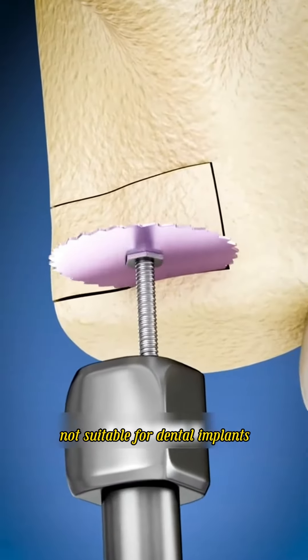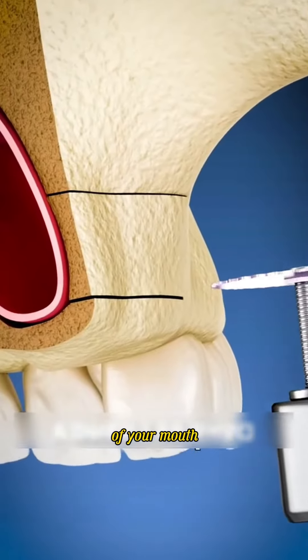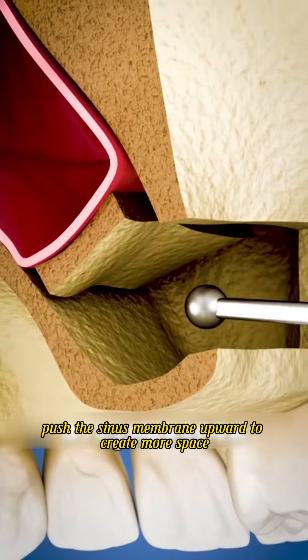If your jaw is too small and not suitable for dental implants, the doctor will use a drill to make an opening in the back of your mouth right below your sinuses, and then push the sinus membrane upward to create more space in your jaw.